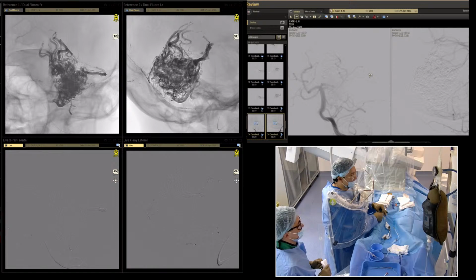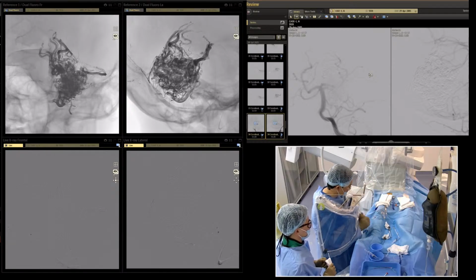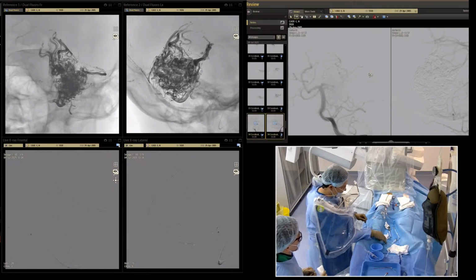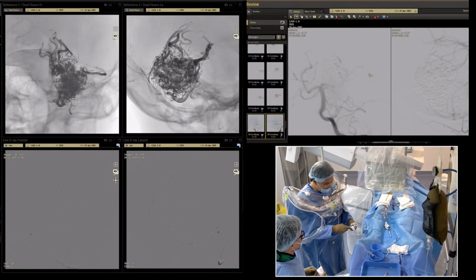Because of the friction inside the guiding, I don't feel how much pressure I put. Can take this then so.